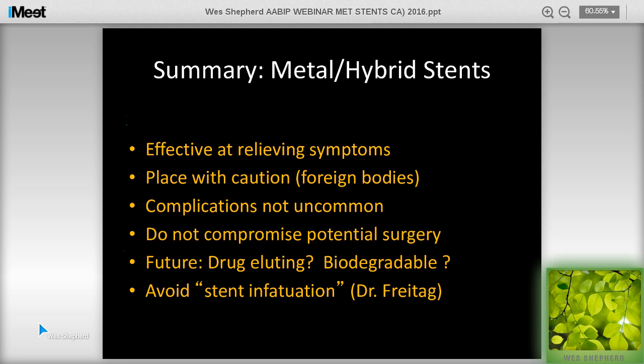And of course, as all of you know, there's very little to virtually no evidence in the literature to support this practice, and all of you probably would give a slightly different answer in what your stent maintenance routine is. But that's pretty much it. We don't use, in most cases, any type of pulmonary muco-clearance device, such as the vest or an Acapella valve or anything like that, unless the patient had some other complicating factors or really profound mucus.